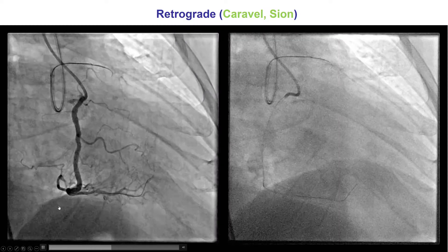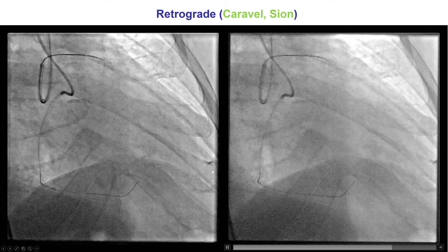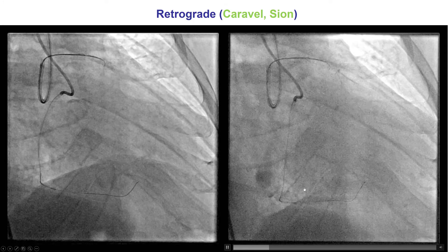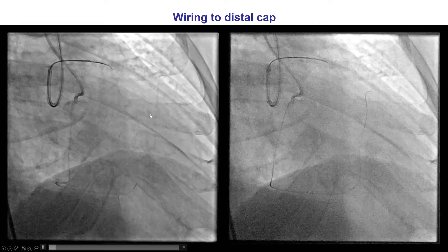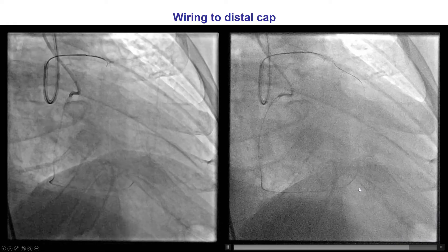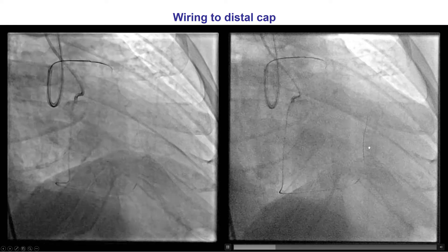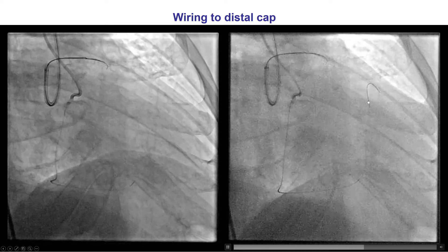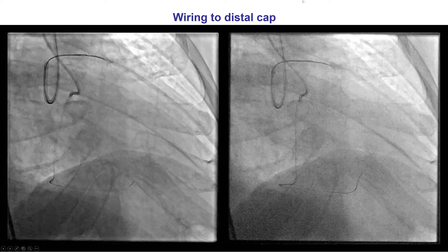Because of the excellent septal collaterals, we decided to switch to retrograde. We advanced a Caravel microcatheter into a distal septal collateral and then did a microinjection demonstrating connection to the LAD. We then advanced a Sion guidewire that initially went into the distal LAD, easily crossing from the septal into the distal LAD, and was then pulled back, redirected, and eventually advanced all the way to the distal cap.